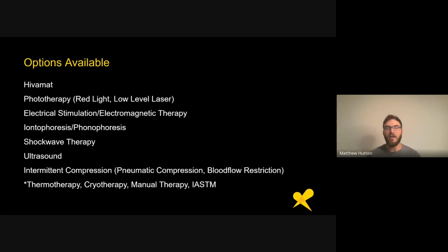We used to do it as part of our lab when we were learning to use ultrasound: you leave it on a superficial bone, like your hand, for example, where you don't have a lot of tissue surrounding it or blocking the bone. You put the transducer right on their hand, and then you are basically letting it sit still until you turn the dosage way up high so that it's emitting this really high frequency.